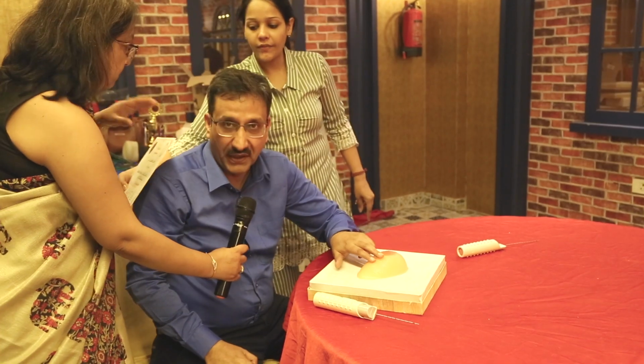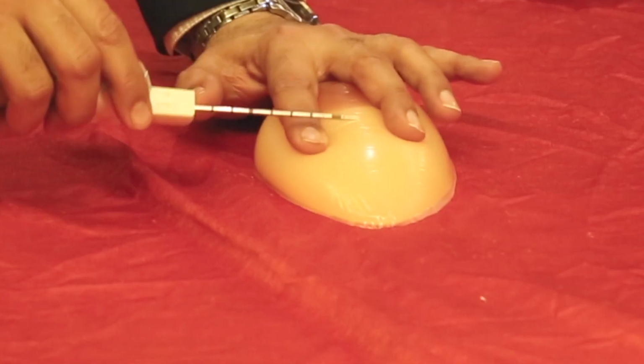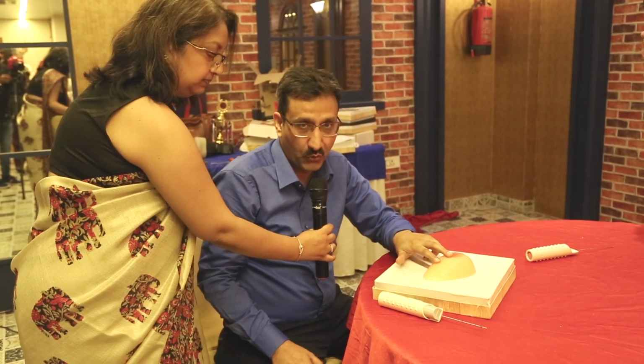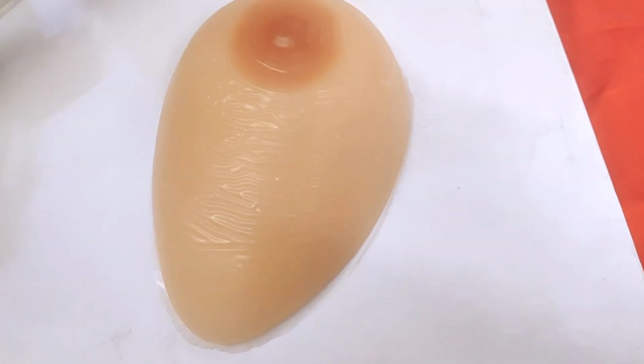Suppose there is a breast lump here. We have to take a true cut biopsy. First, we will localize the lump with 2 fingers. Suppose there is a breast lump here. We have to take a true cut biopsy from it. First, we will localize the lump.